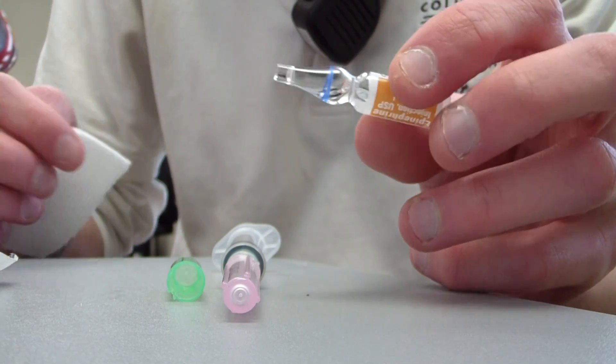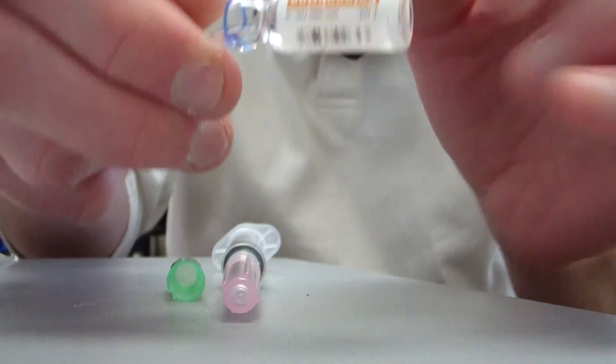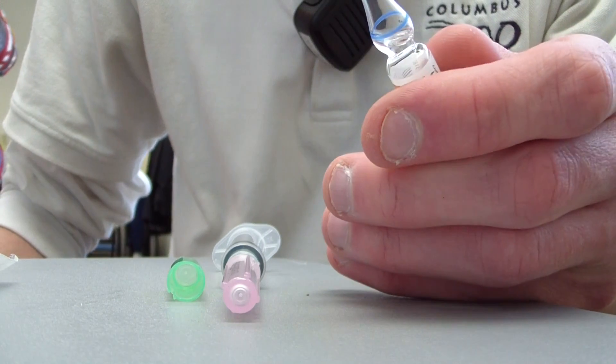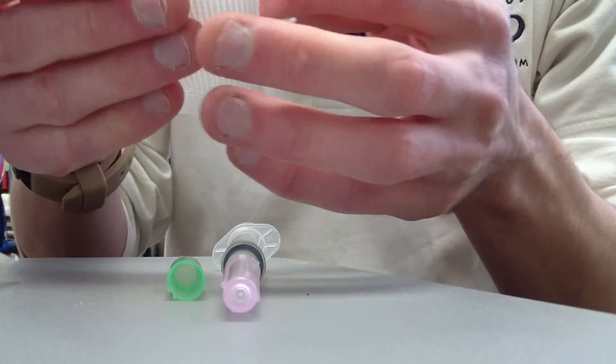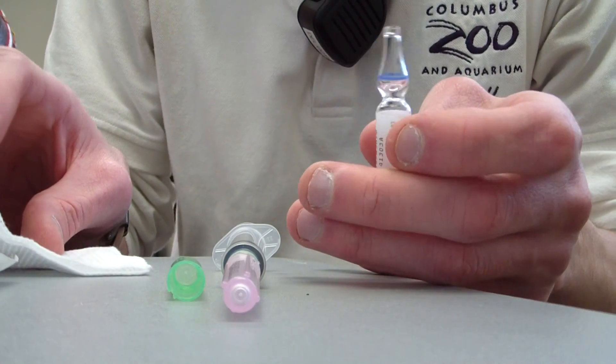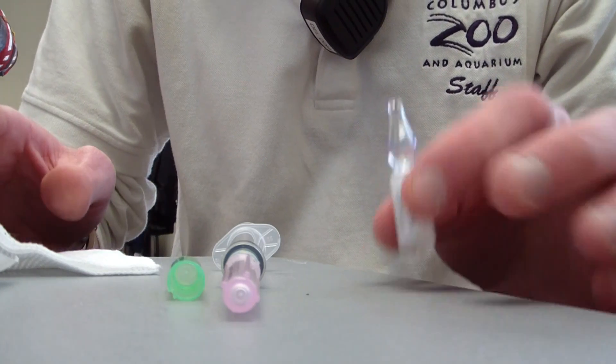You can break the top off like this — around the ring here it's checkered almost, and what you're going to want to do is break it alongside that. Some people use their hands, but you have the ability to possibly get glass in your fingers, so I'd beware of that.